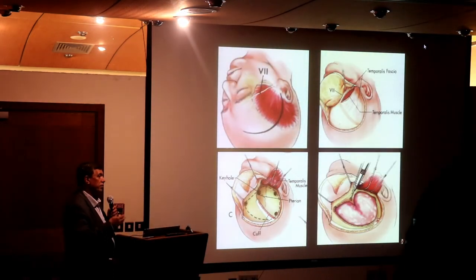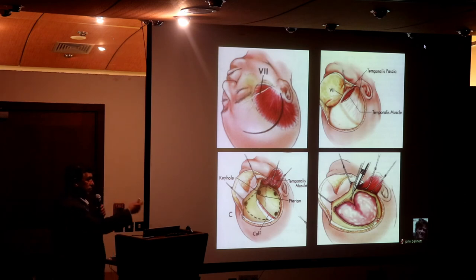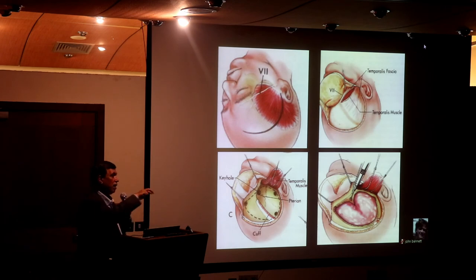You have to prepare for a ruptured aneurysm, not only to clip the aneurysm, but for what to do if it ruptures. One major principle of this is what we call proximal control. So for a middle cerebral aneurysm coming from the internal carotid, I prepare the internal carotid so that if it ruptures, I can put a temporary clip on it.